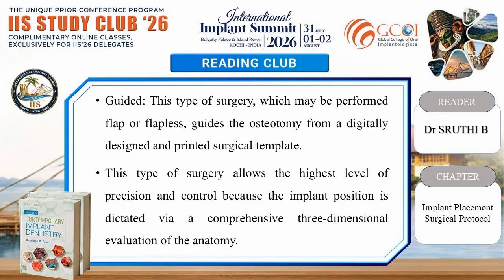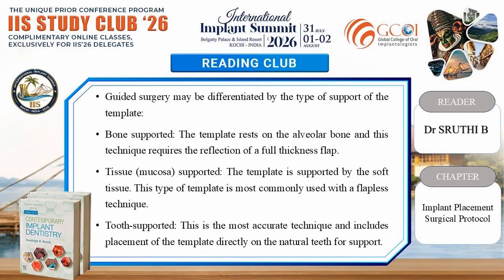Guided. This type of surgery, which may be performed flap or flapless, guides the osteotomy from a digitally designed and printed surgical template. This type of surgery allows the highest level of precision and control because the implant position is dictated via a comprehensive three-dimensional evaluation of the anatomy. Guided surgery may be differentiated by the type of support of the template.